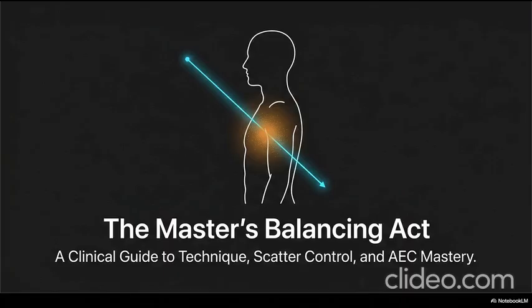The geometry of those alternating lead strips is brilliant. The primary X-ray beam, good radiation, traveling in a straight line from the tube through the patient, passes right through the invisible aluminum spaces and hits the detector. Right, because it's going straight. Exactly. But the scatter radiation, which is flying out of the patient's body at severe oblique angles, crashes into the sides of those microscopic lead strips and gets entirely absorbed. It strips the fog right out of the air, cleaning up the image contrast beautifully.